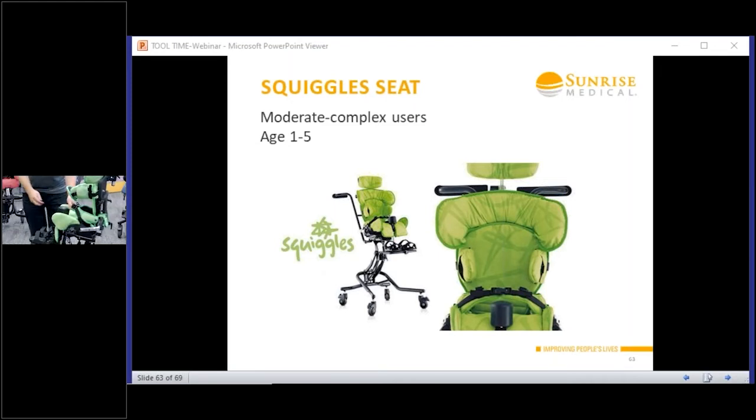Foot plate, you go down a little bit. So you've got that adjustment there, so it's just giving you your plantar dorsa.